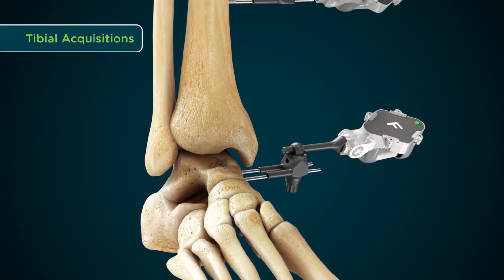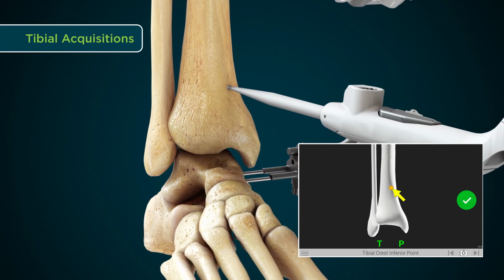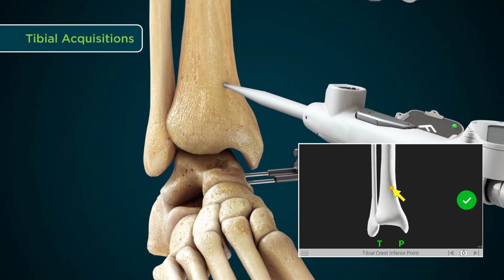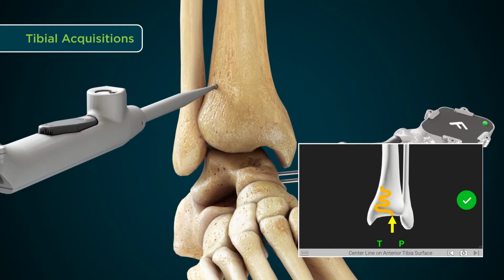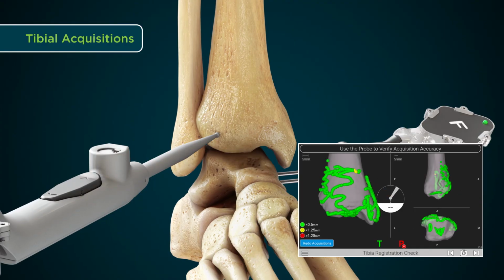Perform the tibial acquisitions. For point acquisitions, place the probe tip on the anatomic landmark, then press and release the forward button on the probe. For patch acquisitions, place the probe tip on the anatomic landmark, press and release the forward button, and then paint the anatomic reference according to the figure displayed on the screen. Do not hold the button down during acquisition.